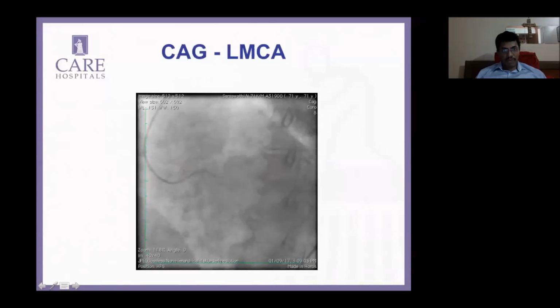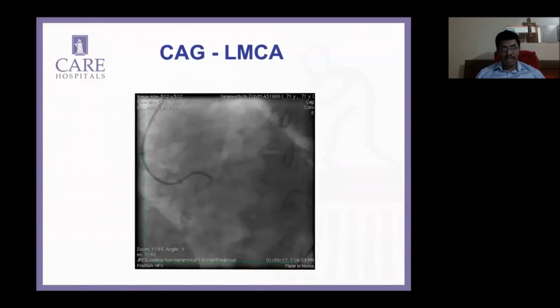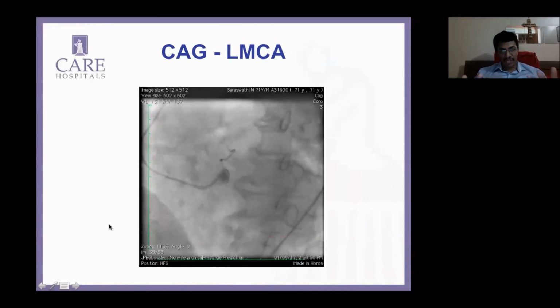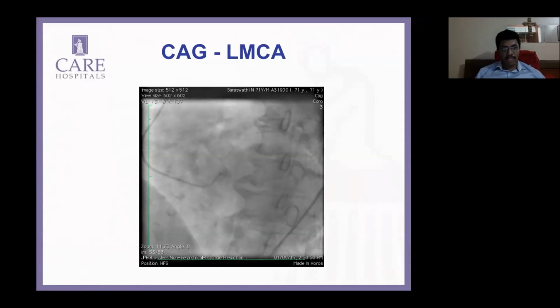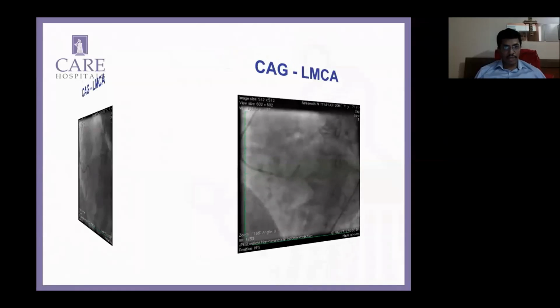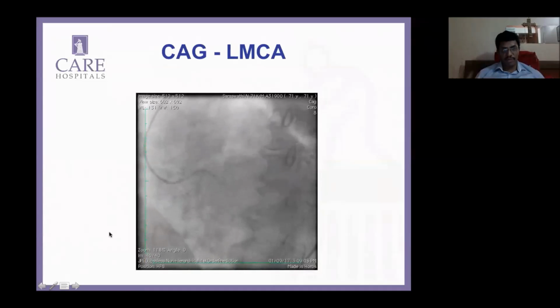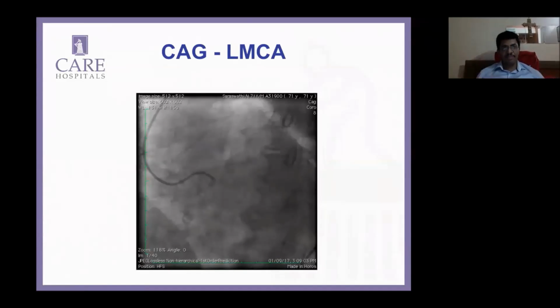Repeated attempts, and I'm going to show you one more attempt. You'll have to believe me on this. This was, I think, the last attempt. Multiple catheters, multiple views, and we just couldn't get the left system. Somebody referred this to me, so I'm just giving you what his view was. So finally, he just gave up. A lot of contrast, and a lot of time later, he just gave me a call and said, "Can you just find the left system for me?"